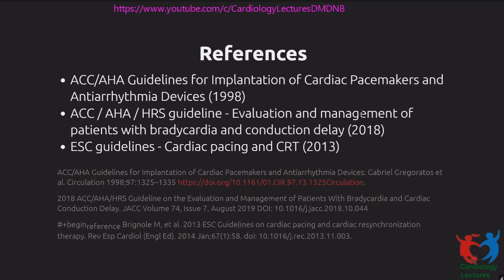Non-apical RV lead, yes. Now we almost never pace patients in the RV apex. We almost always place an active fixation lead, and we place this in the outflow or the mid-septal region of the RV. Typically, it produces a narrower QRS, better ventricular synchrony, and hopefully better long-term outcomes. But like I said, the evidence is not strong.